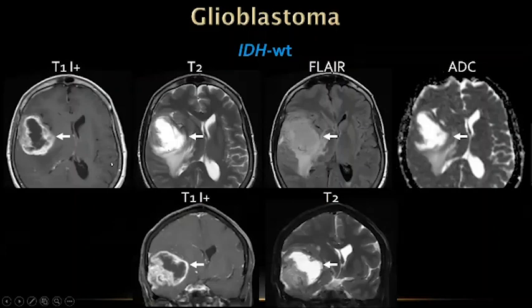And this is now your classic glioblastoma on imaging and histology, very ugly enhancement, internal necrosis, some areas of hypercellularity, and IDH wild type. So that is basically correlating across all of the layers of the diagnosis.